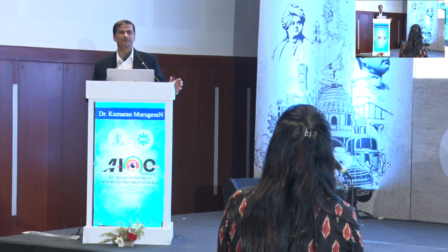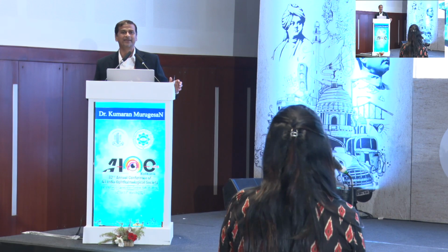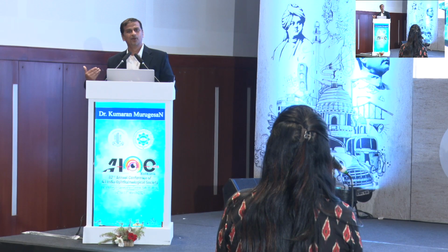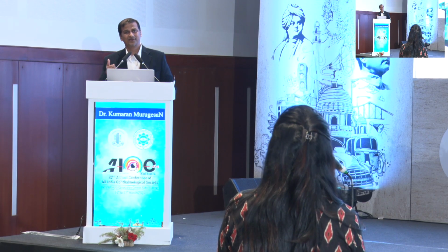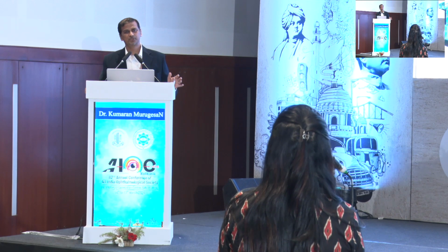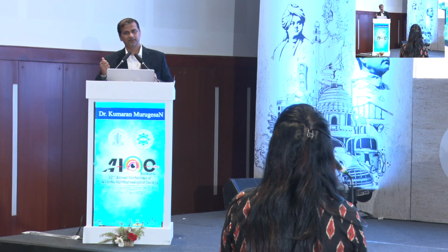because if you switch on the fan, you will never know when it's going to get dried up. And if you ask the sister to switch on the fan, they might come in one day or two days, they might forget. So with a handheld dryer, which most of us would have in our house, that could do the job. Or if you have a high flow air gun, perfect.